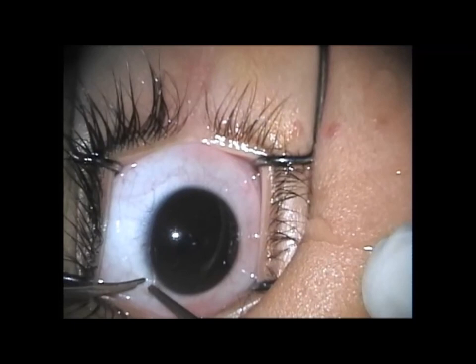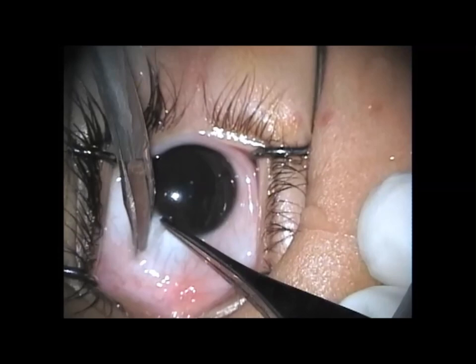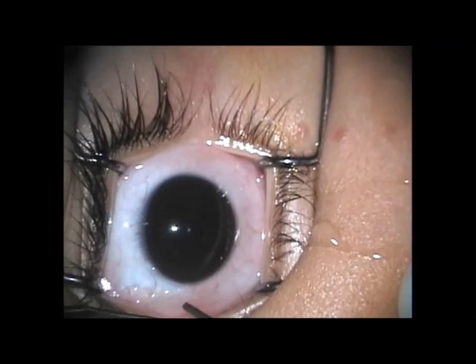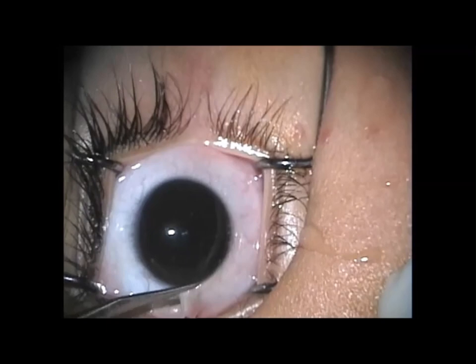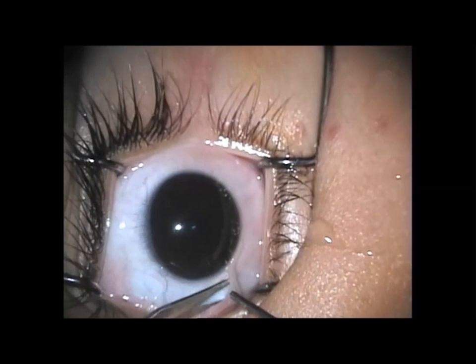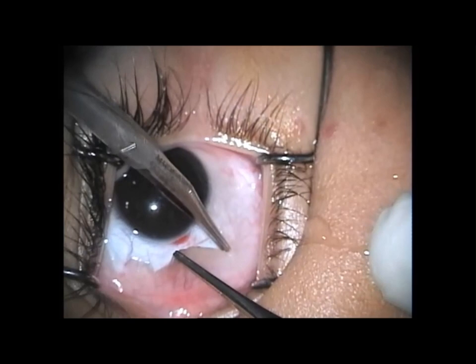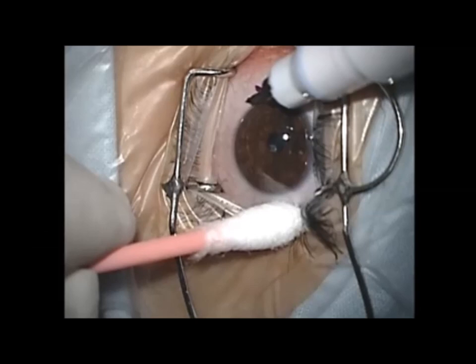The incision usually starts with a small snip at the desired upper or lower poles of the incision. The incision is then extended parallel to the limbus by blunt dissection under the conjunctiva-Tenon complex, followed by short cutting. Notice that at the limbus both the conjunctiva and the Tenon are fused together, so usually the incision cuts both of them at the same time in one layer.